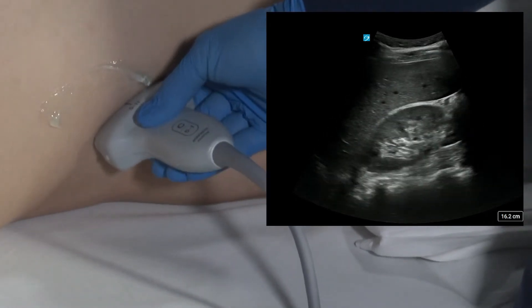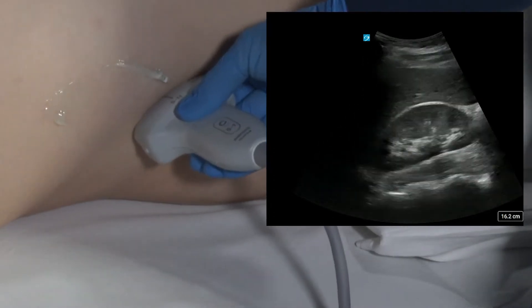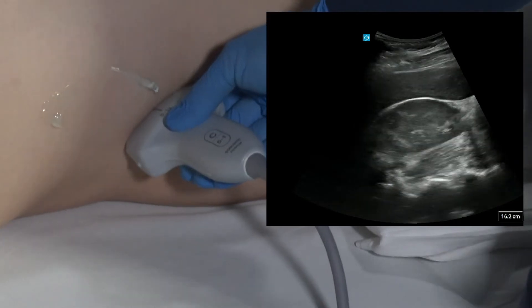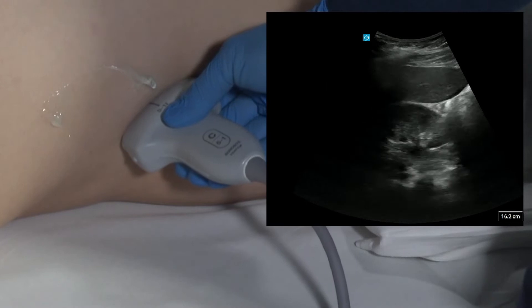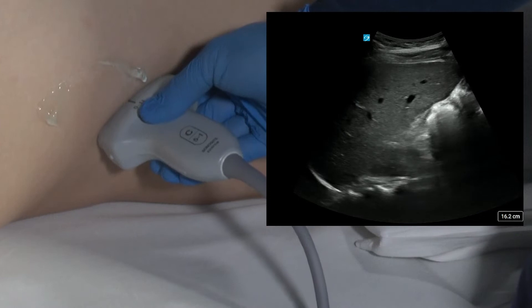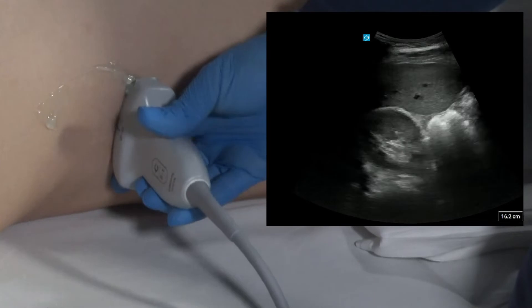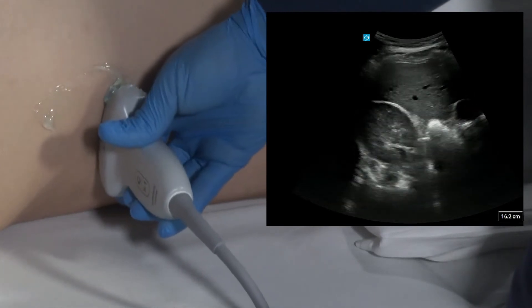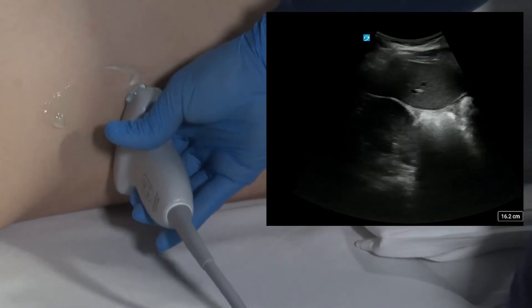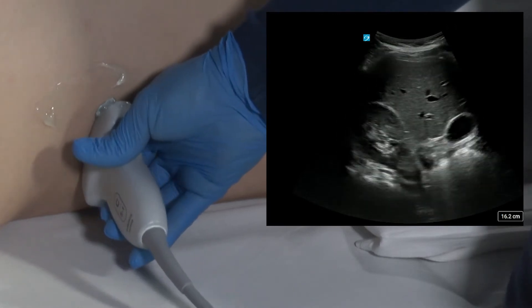Some other things we can do to help our image is to have the patient take a deep breath and move the transducer accordingly. Once we've imaged the kidney in its long axis, fanning all the way through to see the parenchyma and the sinus, we will rotate the transducer 90 degrees so that the marker dot is pointed towards the patient's back. We will fan the transducer back and forth so that we can see the entire kidney in its short axis.